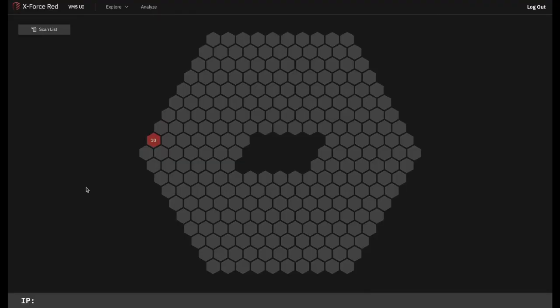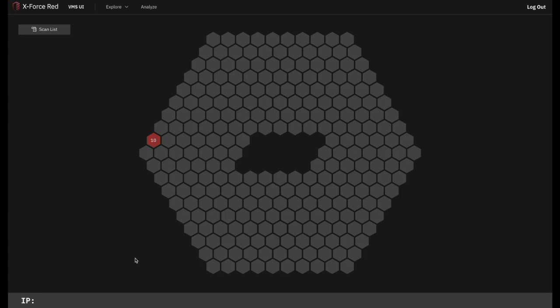When you first log in, you will see a honeycomb structure. It's best to think of this as a three-dimensional heat map that's composed of multiple hexes. At this highest level of the interface, each hex represents an individual hospital network that we can explore.